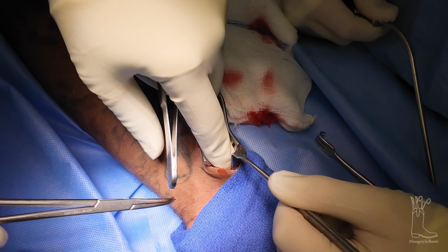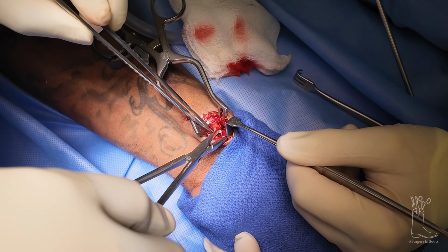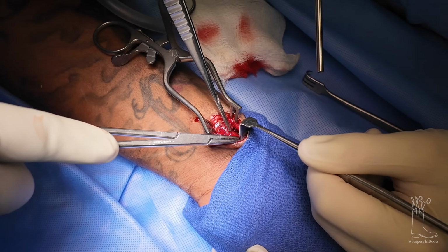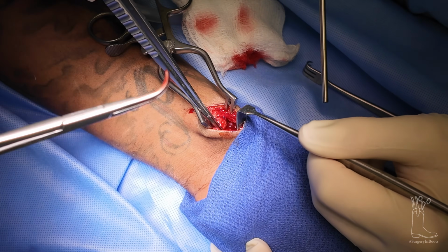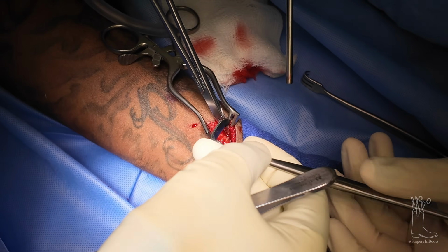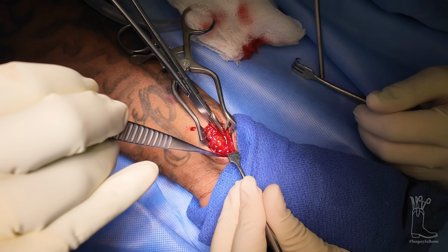Make sure that's not pulsatile, and it's not, which is good, so it's not an artery. Second there for me. Watch your hands. Oh, you got a silk tie? That's fine.